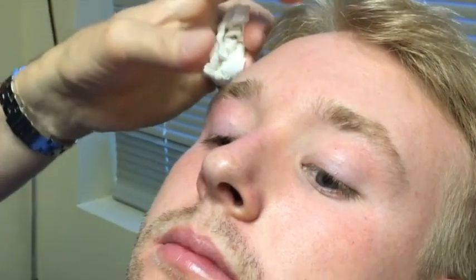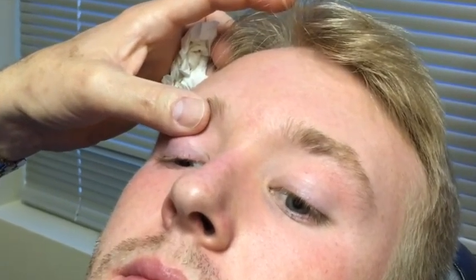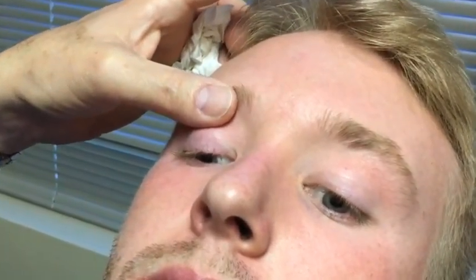That means just flat. You don't come in at an angle like this. You come in flat right here. Now I want to be just above the lid crease. Just above the lid crease. That's the top of the tarsal plate. We're just above that. Now my thumb is not going to lift. See, lifting doesn't expose anything. We don't want to lift.